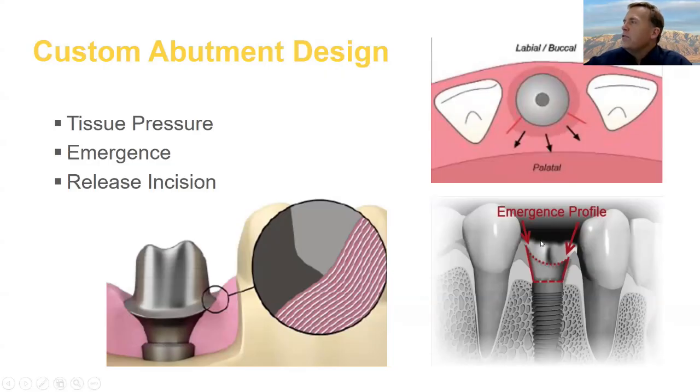And so something that you can do is we can contour, kind of like we would with a custom healing abutment. We can contour the abutment exactly how it ought to be. And then it's not going to seep when you just set it in the mouth.